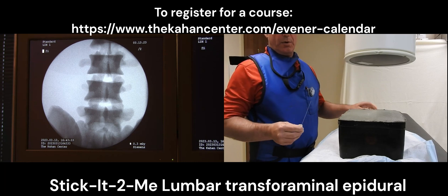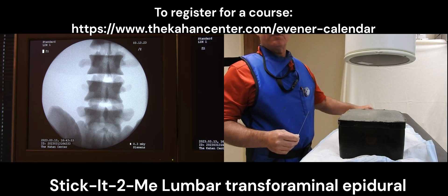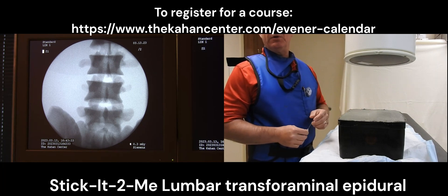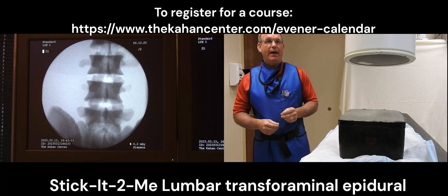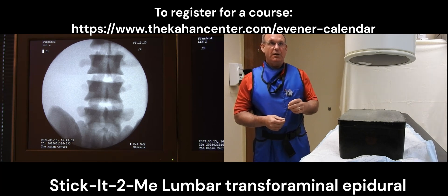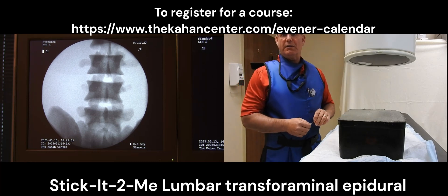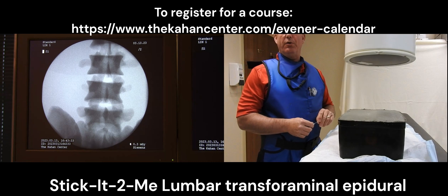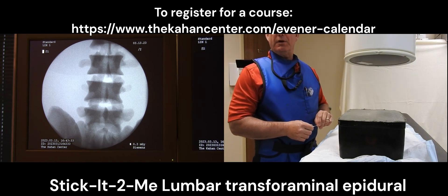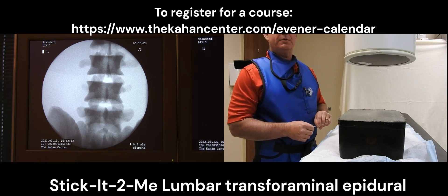Today we're going to practice with a lumbar transforaminal injection. I'll be doing it on the left side and I will demonstrate how we utilize Stick It To Me to perform these injections. We can then practice them over and over again until we get the confidence of learning how to control the bevel and the steerability of the needle before we actually utilize these on a live person.